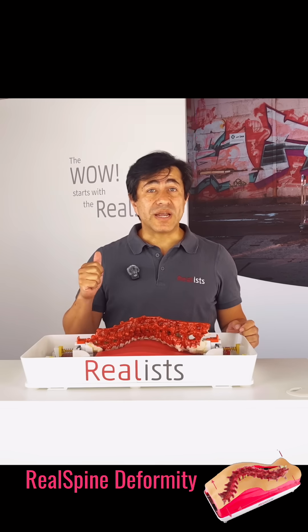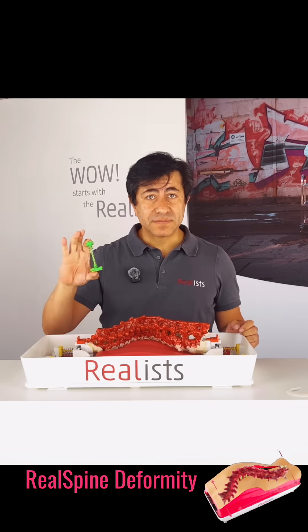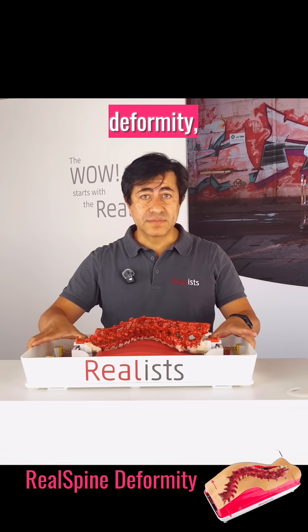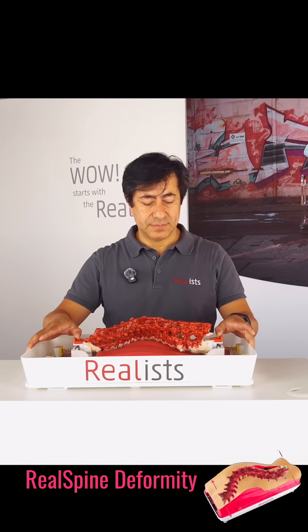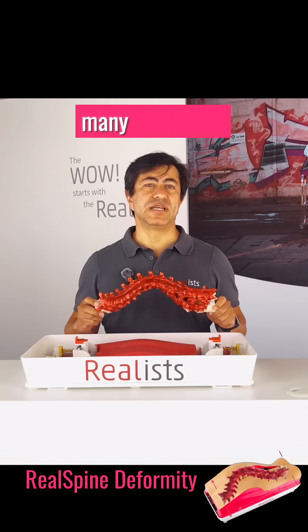Just one pathology? Not at all. You can adjust levels of resistance, simulate different degrees of deformity, and also swap the spine. One simulator, many challenges.